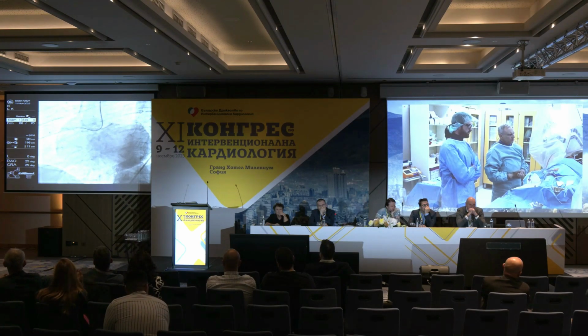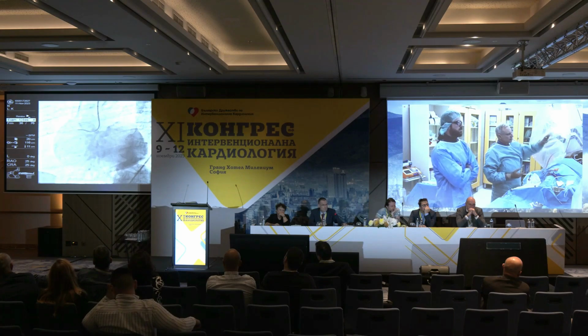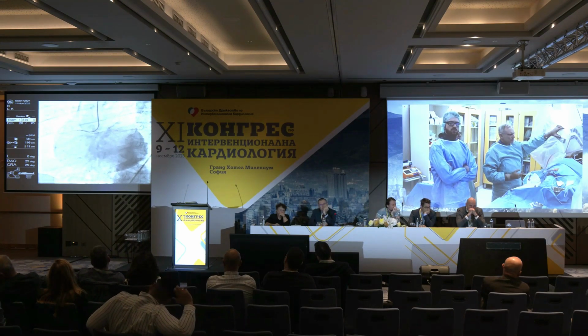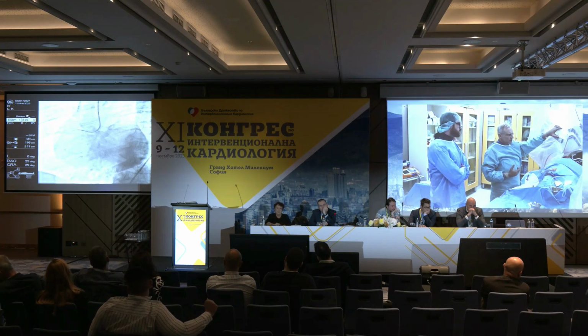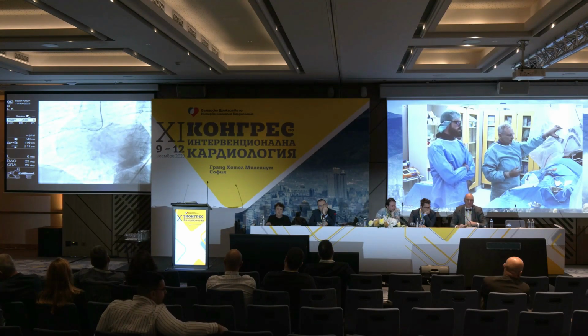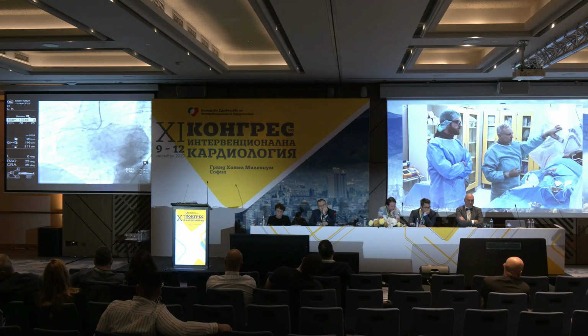The feeling was that blunt caps, generally speaking, are not easy to puncture, especially when it's proximal and the vessel is big. Here you see a Gaia 3 wire. The cap might not be extremely calcified, but definitely the vessel is big, and with wires with a short tip like the Gaia 3rd, you can appreciate that we failed completely to puncture. There was no way that we could puncture there.